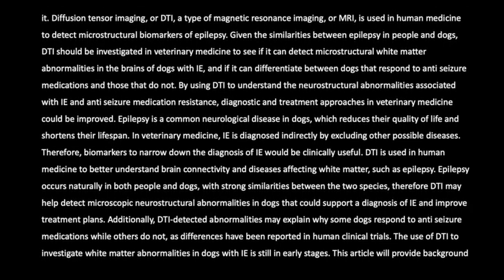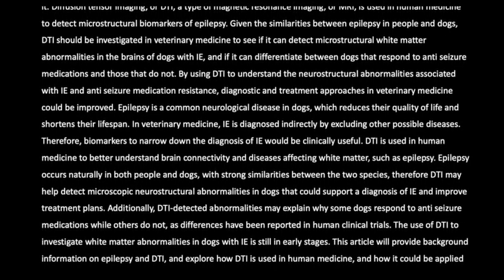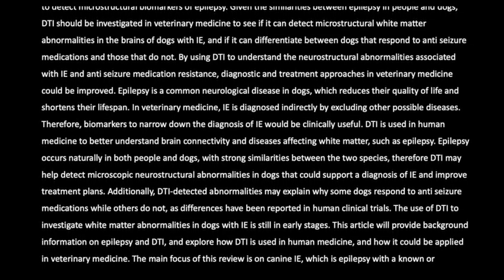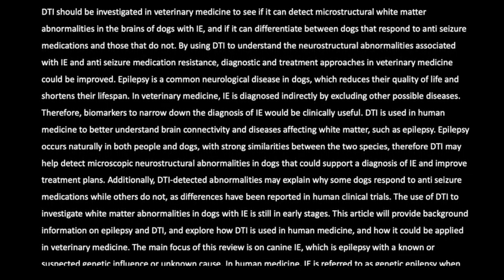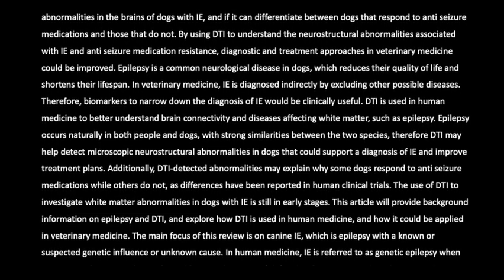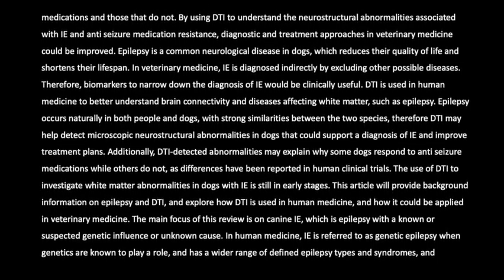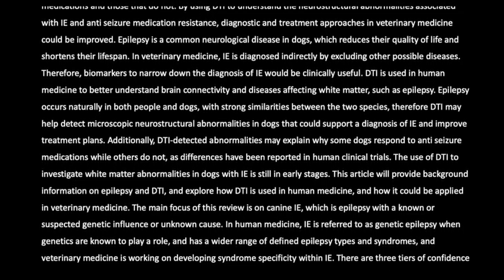Epilepsy is a common neurological disease in dogs, which reduces their quality of life and shortens their lifespan. In veterinary medicine, IE is diagnosed indirectly by excluding other possible diseases. Therefore, biomarkers to narrow down the diagnosis of IE would be clinically useful. DTI is used in human medicine to better understand brain connectivity and diseases affecting white matter, such as epilepsy. Epilepsy occurs naturally in both people and dogs, with strong similarities between the two species.